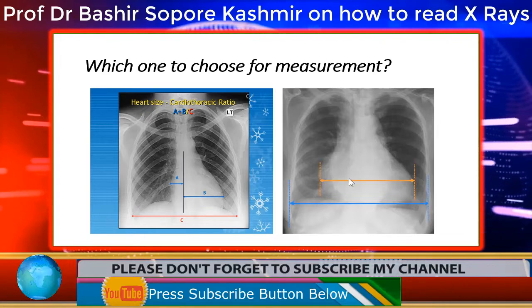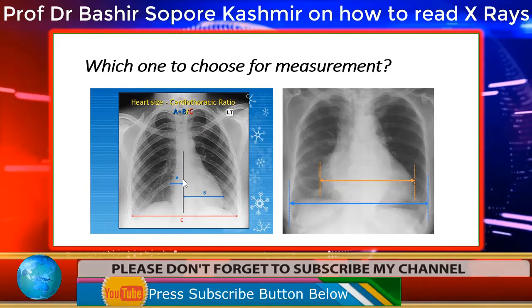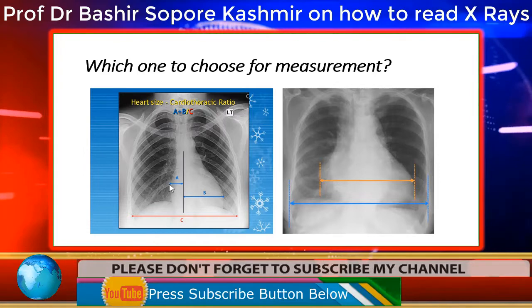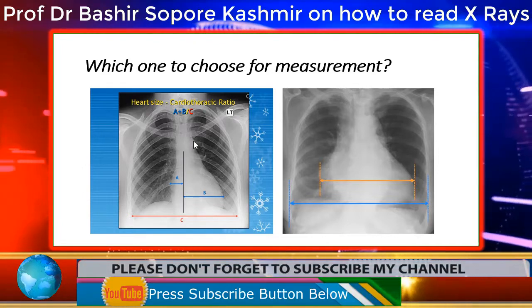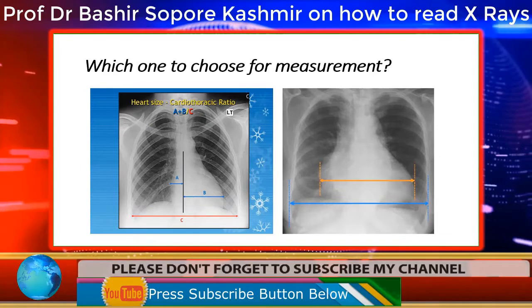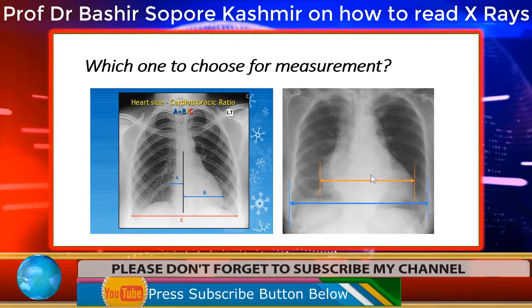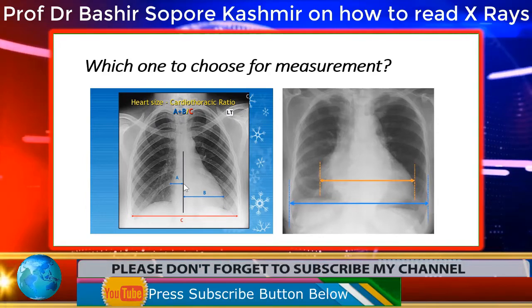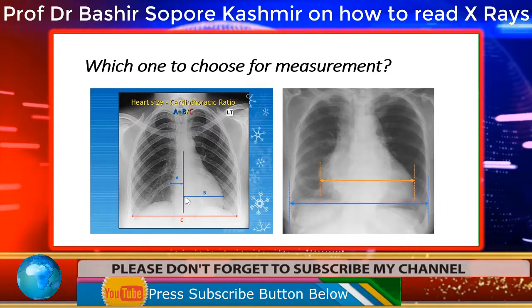Now my question is, should we measure like this or should we measure like this? Please remember, you should always measure like this. Why? Because you have to see whether the right side of the heart is one third or it is more than one third. That can only be judged if we do the measurements as shown in this image. Right? I hope that you will remember it throughout your life. Because some of the books show measurements like this. So much better is if you measure like this, then it will give you the size of the right border as well, the size of the right side of the heart as well as the left side of the heart.